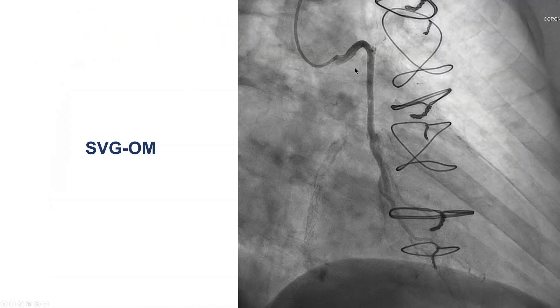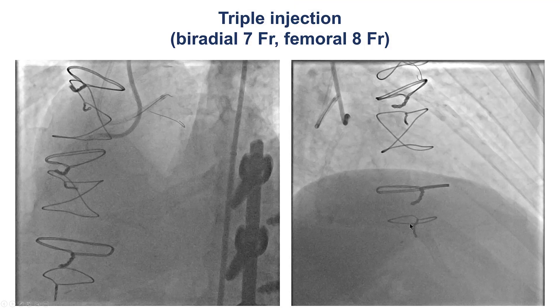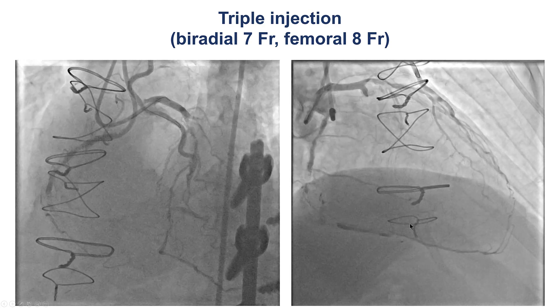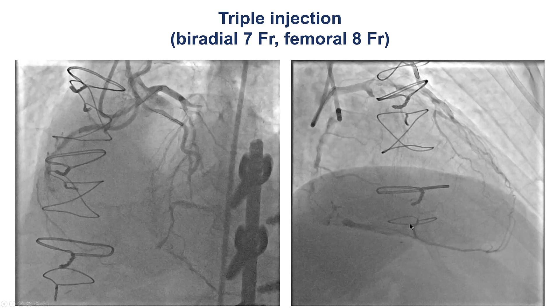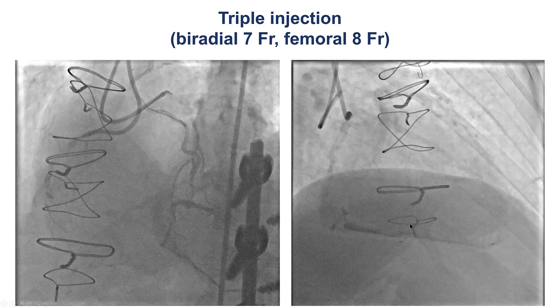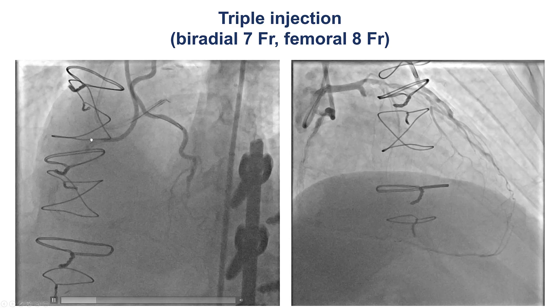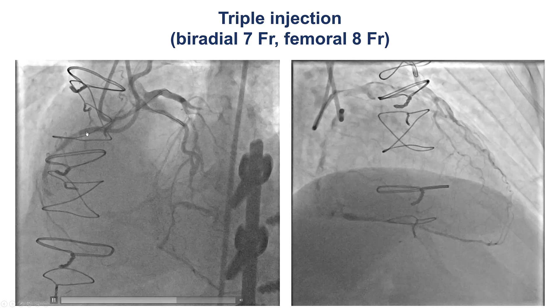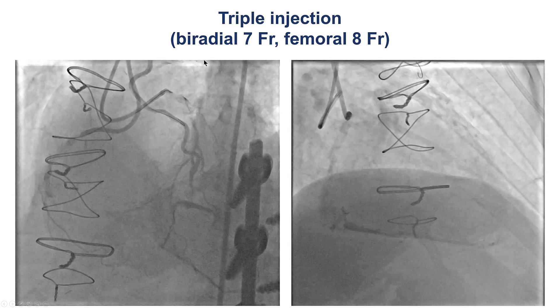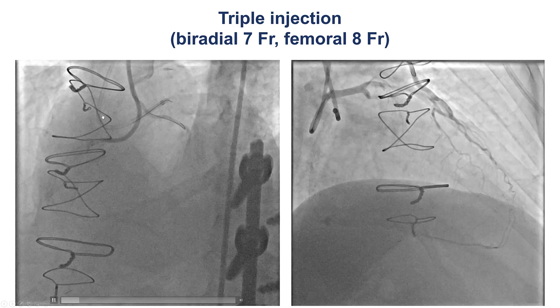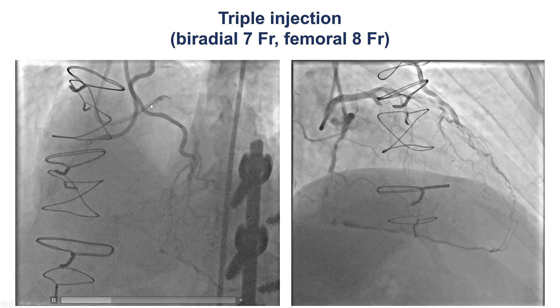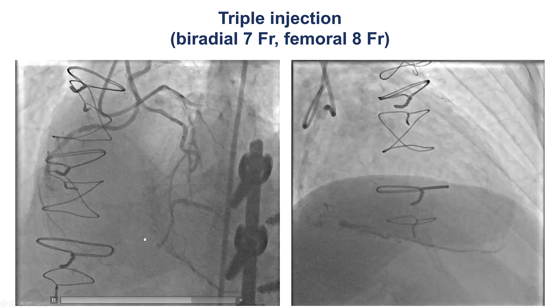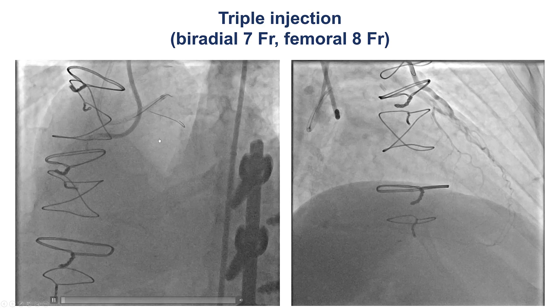This is the image of the SVG to the obtuse marginal that was patent. Patients like this may benefit from triple injection, in which one injects the bypass graft or more than one bypass graft. In this case, we had antegrade injection of the right coronary artery engaged through femoral access, then biradial access. One catheter on the left was a LIMA catheter, and the other was an EBU guide filling the left main. This triple injection was very important for clarifying the anatomy.